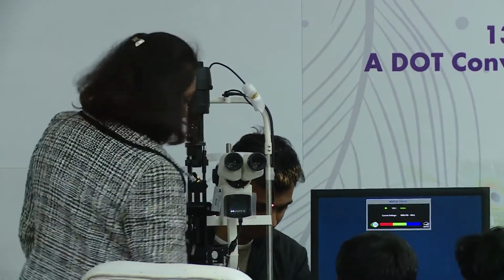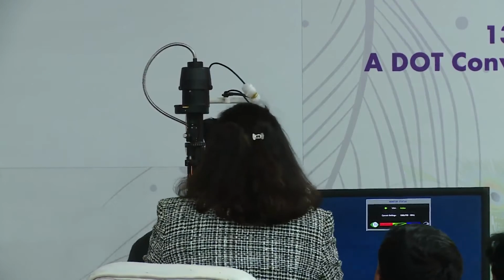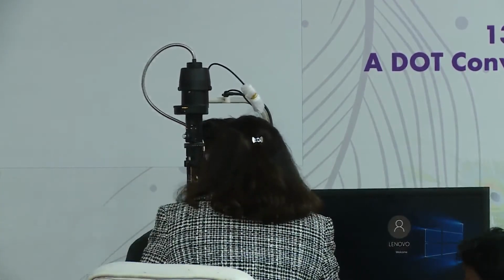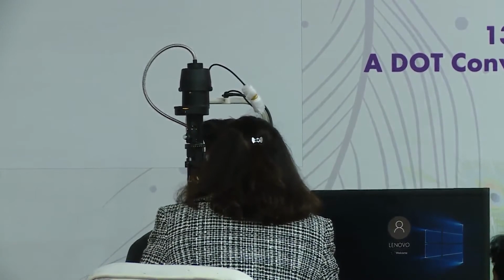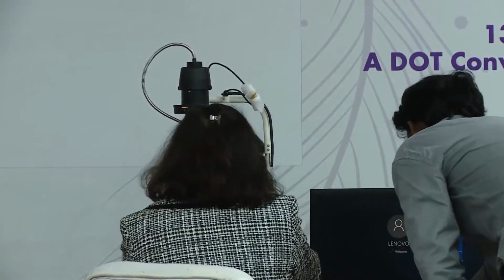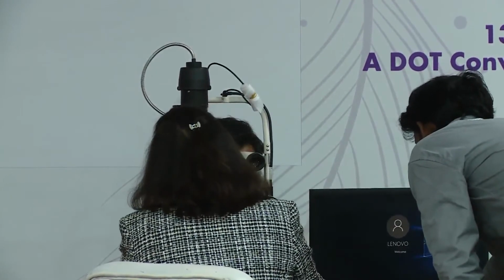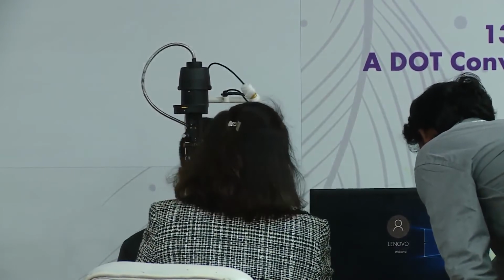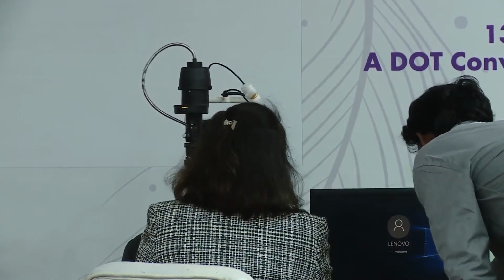As has been said, when we put the trial lens on the eye, we have put fluorescein in already when we inserted the lens. So it has to be pre-inserted, and that's the base curve, which has been the first empirical calculation, which has been put on the eye. And now we're going to observe. And as Dr. Paul had said, we look at the highest point as the center.